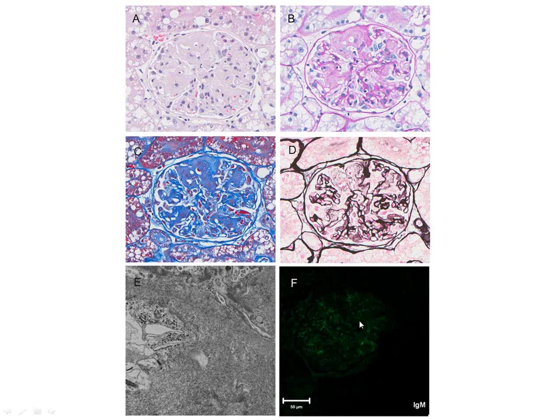Yeah. And one of the things that is true is that the way we cut our slides, we purposely make serial sections and have them stained with different stains so we can go back. The beauty of this is that you get a collective impression by comparing the same glomerulus, or almost the same region, with different stains, and you get a composite message from looking at all of them that is more informative than just picking any one.